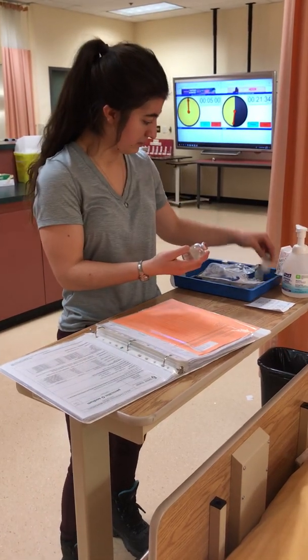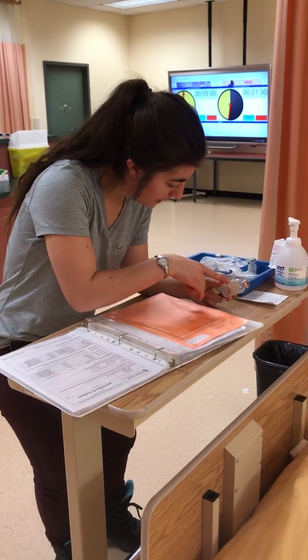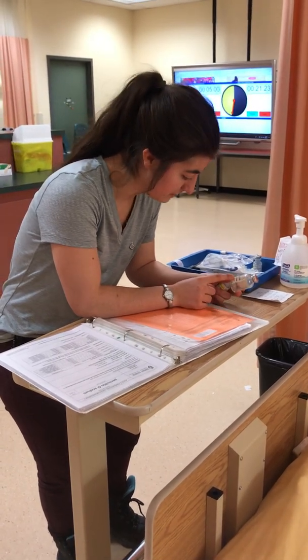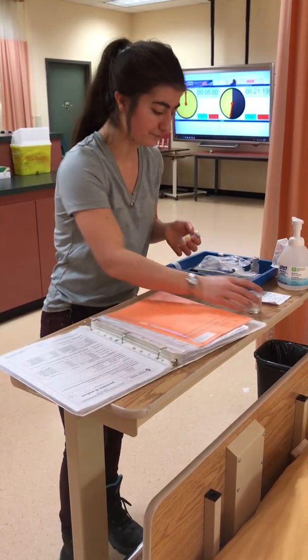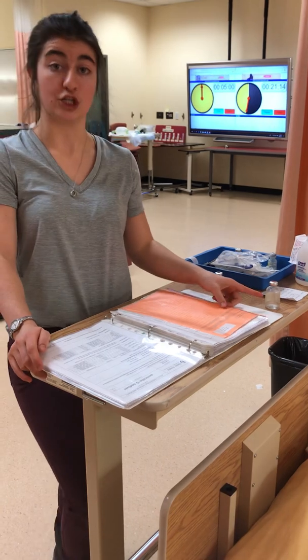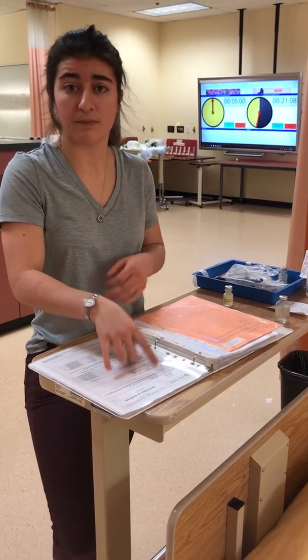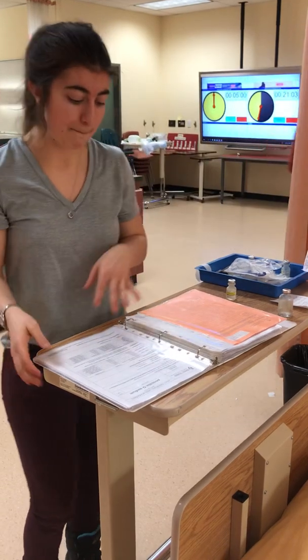I have penicillin G sodium. This is 5 million units, so I'm going to be reconstituting this and then taking some away. It is for an IV medication, and it's the correct time to give it. Now I'm going to be looking at the parenteral drug monograph just to make sure I understand what I need to do with this med. So penicillin G sodium is an antibiotic, and my patient is using it because they have cellulitis in their left arm. So this will be helping to hopefully get rid of that.